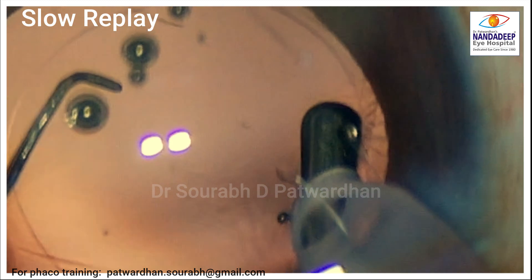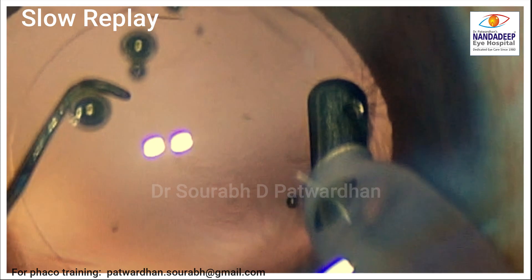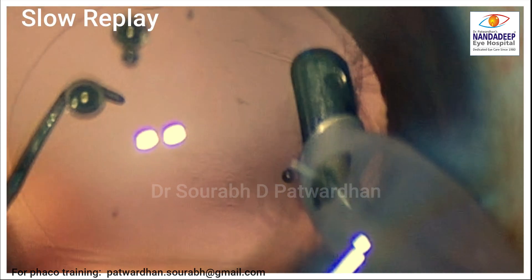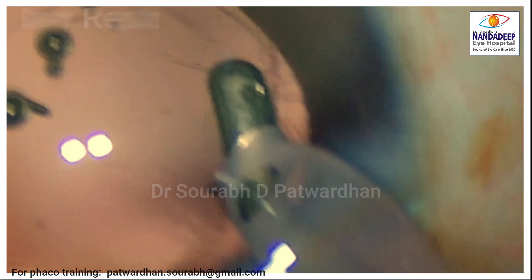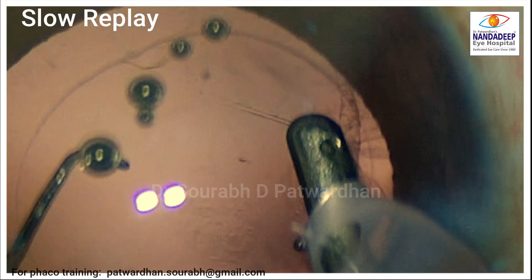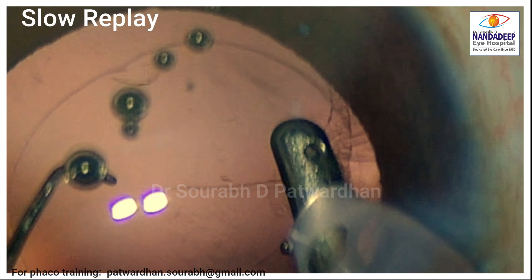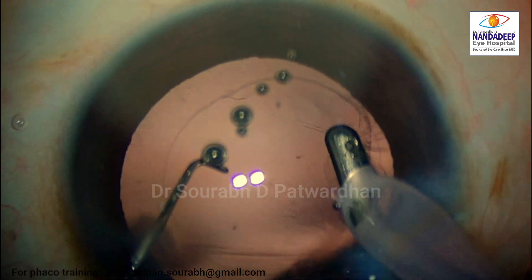Let's look at it in slow motion replay — you can find that the posterior capsule has been caught in the IA probe. If I try to move the IA probe vigorously at this point, it might tear the posterior capsule, causing a posterior capsule rupture. So in this case, I have to keep the probe very steady and then hit the reflux button.